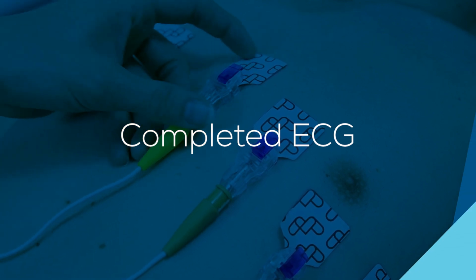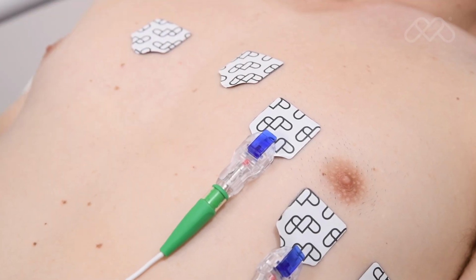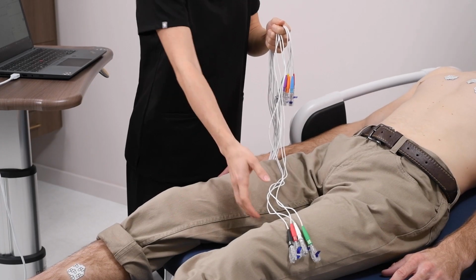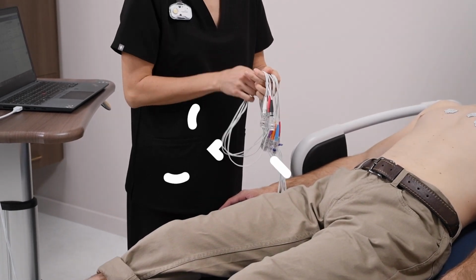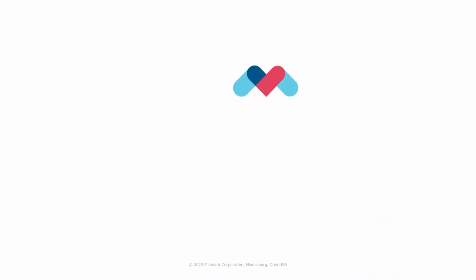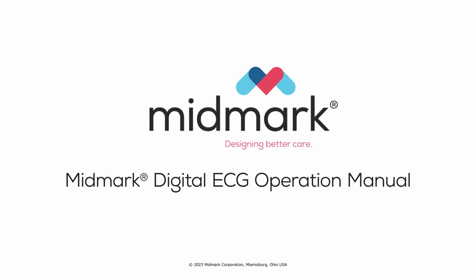Completed ECG. When the ECG test is completed, remove the ECG clips from the electrodes, then remove the patient cable from the patient and set aside. For more detailed information about performing a test, please refer to the Midmark Digital ECG Operation Manual.